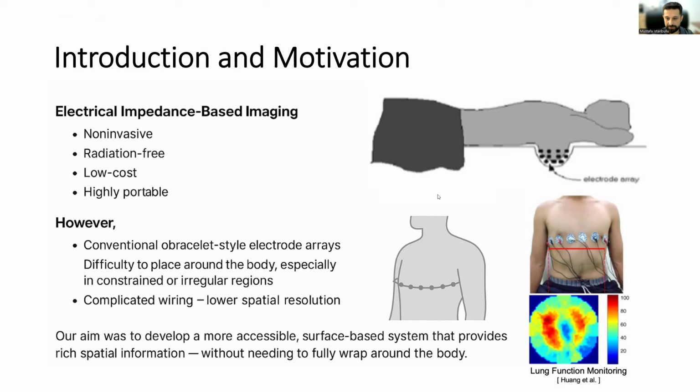Electrical impedance-based imaging offers a unique set of advantages. It's non-invasive, radiation-free, low-cost, and highly portable, which makes it appealing for use in dynamic bedside or point-of-care scenarios. However, conventional electrical impedance tomography systems are not without challenges, of course.